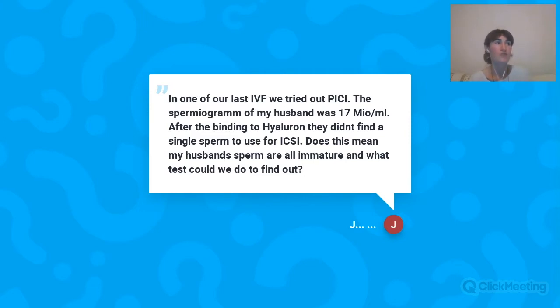They will have processed the sperm sample and looked several times. But maybe when you're not expecting this, because it's very unusual, you did not prepare with enough time in advance. So it could be that, even though it's difficult, with more time in advance knowing this, it's possible to find some sperm cell which is mature.